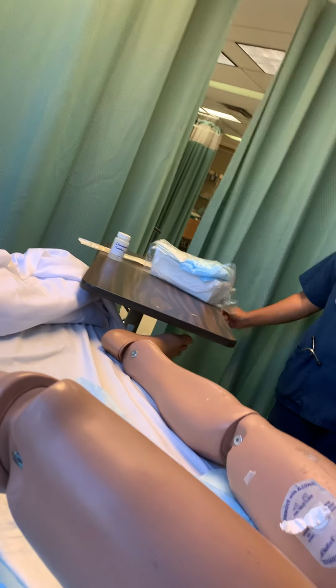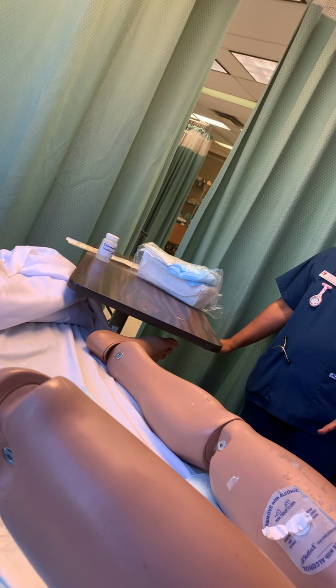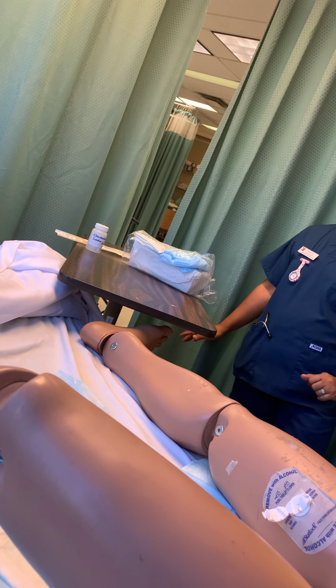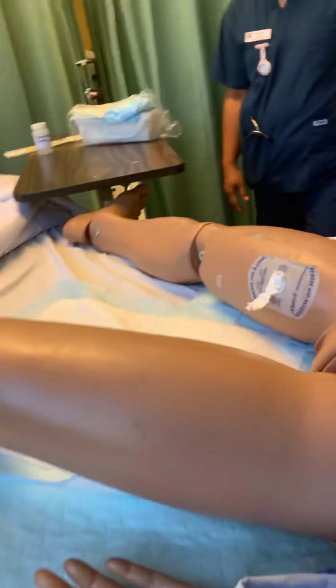So at the same time, I have to do a safety check. There's no clutter on the floor. The bed is lowered and locked. And if they have oxygen, it's flowing well. The IV is dripping well. If they have a catheter bag, it's supposed to be lower than the bladder.